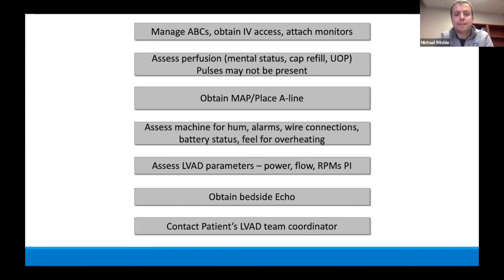And then you want to contact the patient's LVAD team coordinator. So if you're at a site in the future that has VADs and a VAD team, then you would call them. But otherwise, you would just try to find where they come from. And then usually they'll get them transferred over to their center, to their hospital, as soon as they're stabilized.